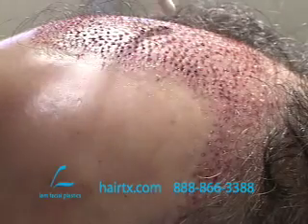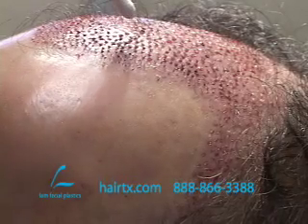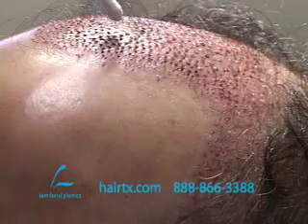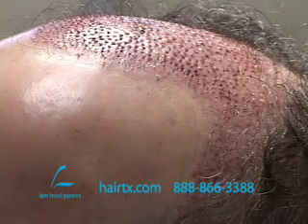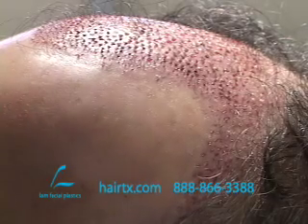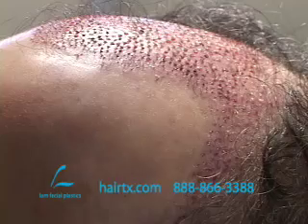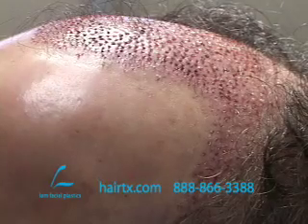In the central density here, in the idea of the extended central forelock, which you may have remembered from another video, if not, you can review that idea, which is to create maximal density from the center here all the way back toward the crown. That central corridor, or extended central forelock, is a prime focus of density. What we've done is very tiny little round punches that are 1.2 millimeters. And the benefit of doing this is it takes the bald scalp out and puts in new hair.